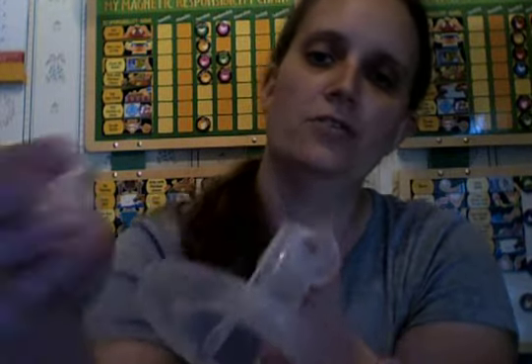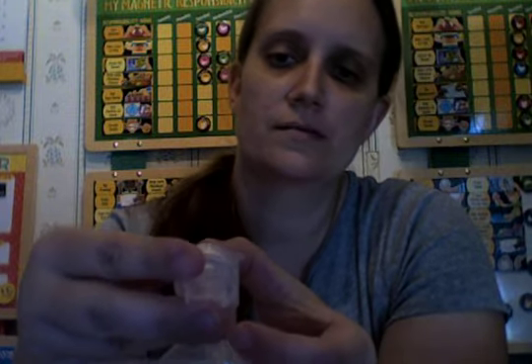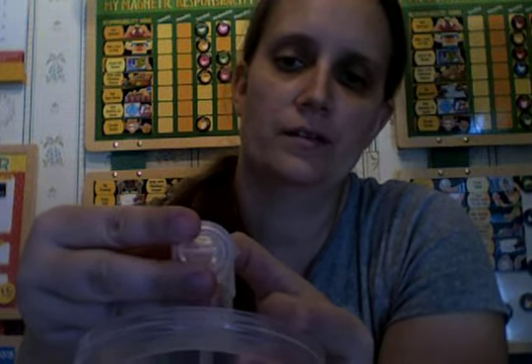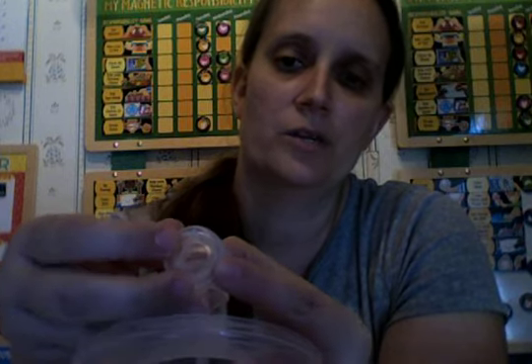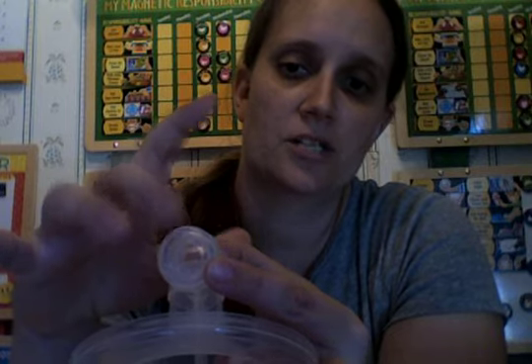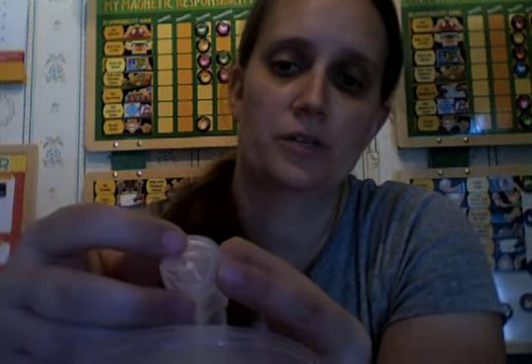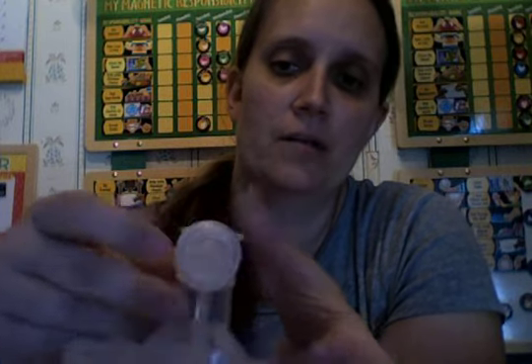Then you're going to take your little rubber thing, and when you put it on, it needs to go to where it's parallel with this part right here. If you turn it this way, when you put the cup on it, it's going to actually hit it, and you're not going to get any suction. You might even get some milk in your tubing and stuff. So it's really important that this is flat, so that when you put the cup part on, it doesn't touch.